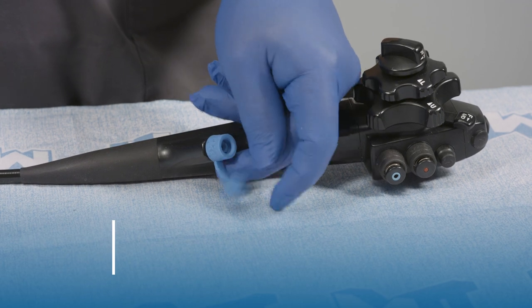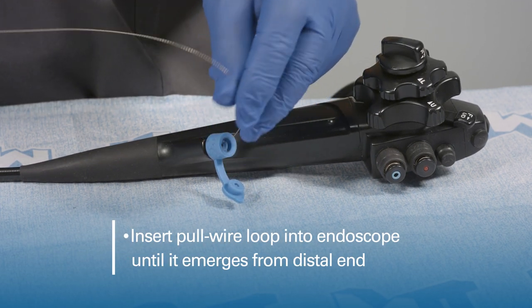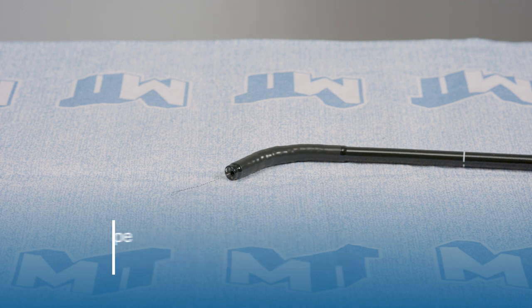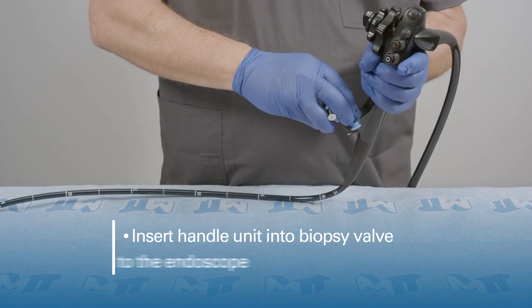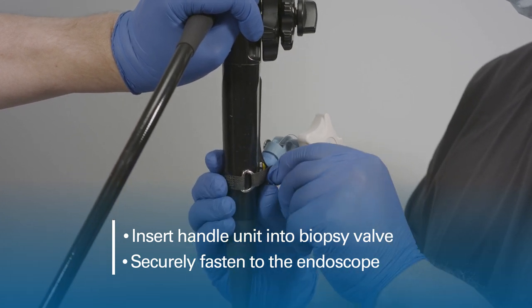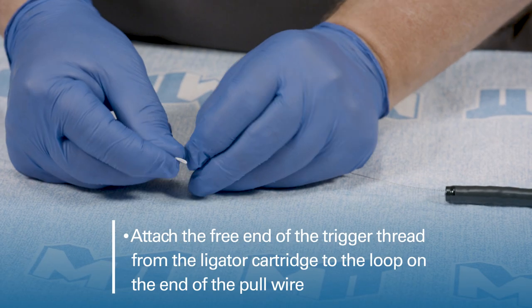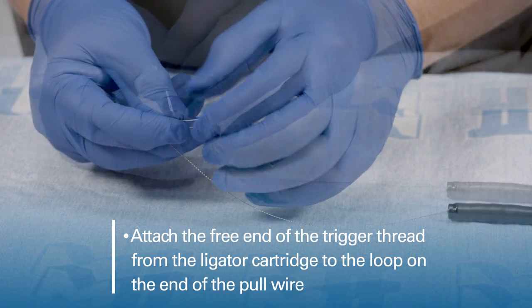Open the biopsy valve and introduce the looped end of the pull wire into the valve until it emerges out of the distal end of the endoscope. Insert the handle unit into the biopsy valve and secure the handle unit into the endoscope using the hook and loop strap. Attach the free end of the trigger thread from the ligator cartridge to the loop at the end of the pull wire.